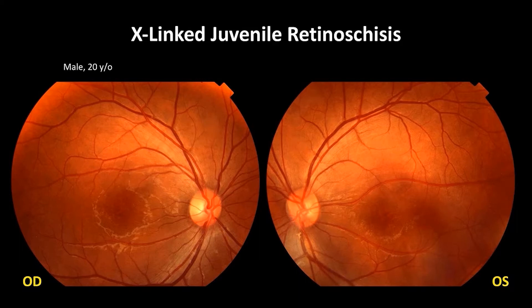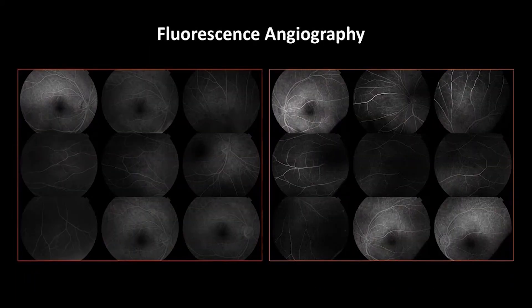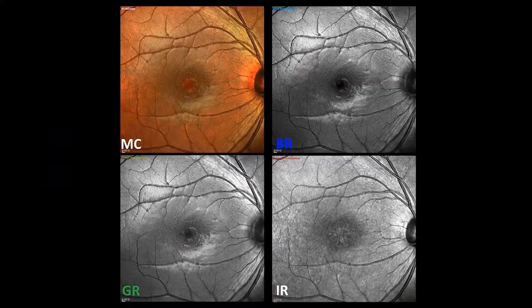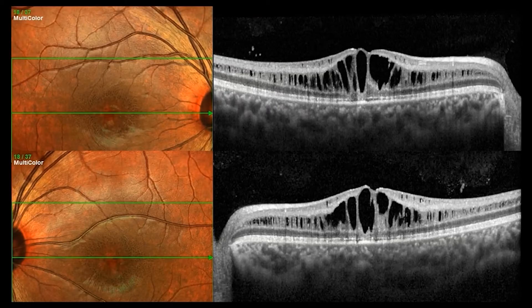This is a case of X-linked juvenile retinoschisis. On color fundus photo, it is not very easy to recognize the abnormality in the macular area. Fluorescein angiography looks basically normal. But when we do multicolor imaging, it showed honeycomb changes in the macula, especially on blue and green reflectance, as well as multicolor on both eyes. Combining with OCT, we can tell that the patient has retinoschisis with no doubt.